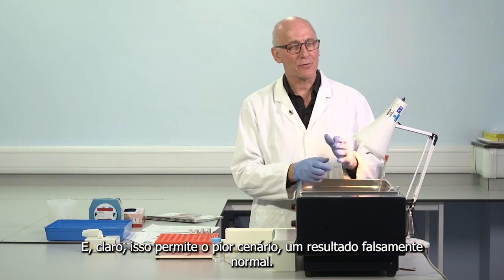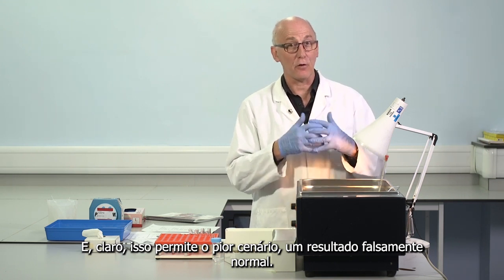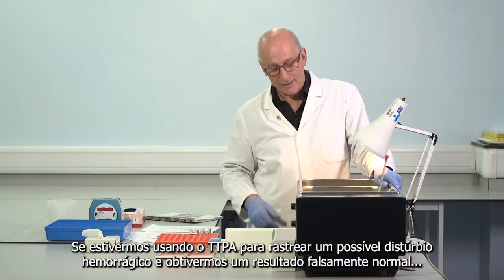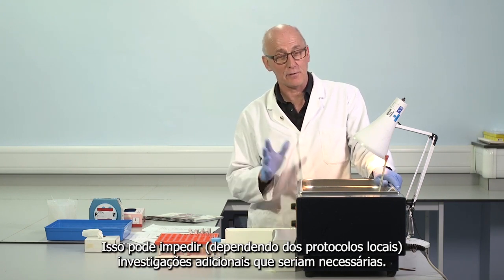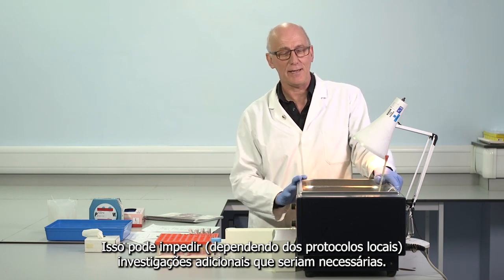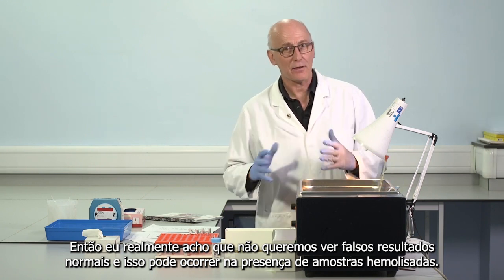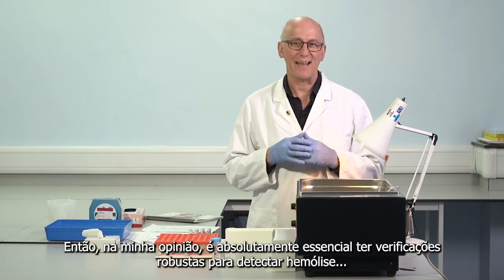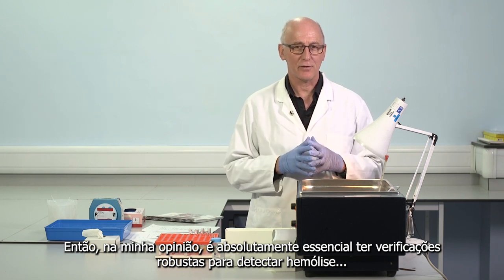And of course that allows really the worst scenario, which is a falsely normal result. If we're using APTT to screen for a possible bleeding disorder and we get a falsely normal result, that could prevent, depending on local protocols, additional investigations that would have been needed. So I think we really don't want to see false normal results, and that can occur in the presence of hemolyzed samples.